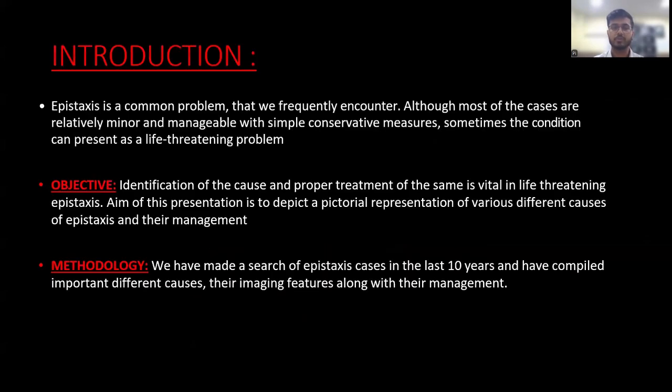So, introduction. Epistaxis is a common problem that we frequently encounter. Although most of the cases are relatively minor and manageable with simple conservative measures, sometimes the condition can present as a life-threatening problem. The objective is identification of the cause and proper treatment of the same, which is vital in life-threatening epistaxis. The aim of this presentation is to depict a pictorial representation of various different causes of epistaxis and their management.